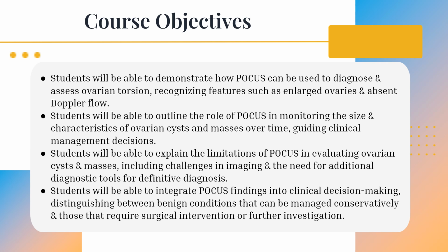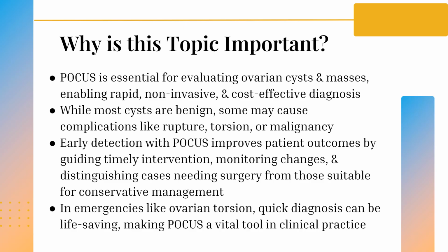Students will be able to explain the limitations of point-of-care ultrasound in regards to evaluating masses and cysts, the challenges it comes with imaging, and the need for additional diagnostic tools to get a definitive diagnosis. Students will be able to integrate point-of-care ultrasound into clinical decision-making, being able to differentiate between benign conditions and more serious ones to help with managing conservatively versus being more aggressive with collaboration and surgical management.